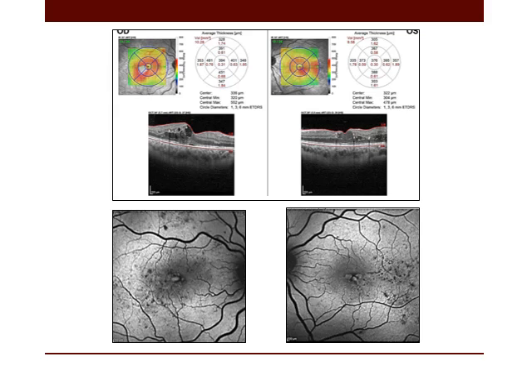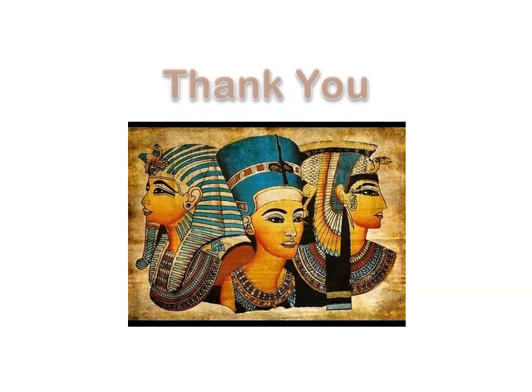Autofluorescence can highlight the outer retinal changes like previous laser therapy atrophic changes, but it will not add to the leakage that much. However, it will be a useful adjuvant if you can perform it. Thank you.